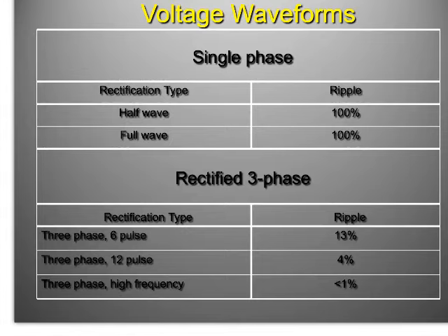So let's talk, I'm changing gears now to talk about voltage waveforms. This is that weird little squiggly line, revised, okay? In our textbook, the best illustration of it is on page 139. We're talking about X-ray generators, how these generators control power. We've said that alternating current is what is produced from our electrical generators, right? It also is how we can control motors. So it is useful. It's very, very useful.